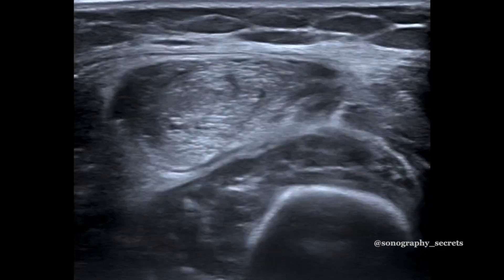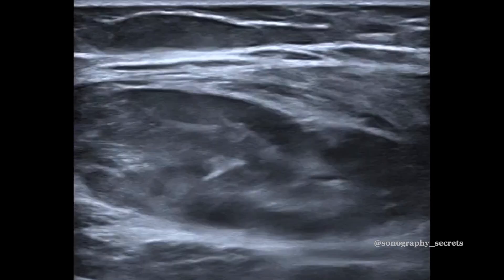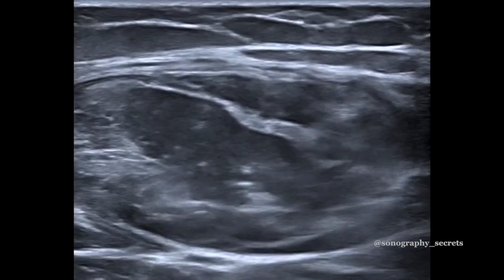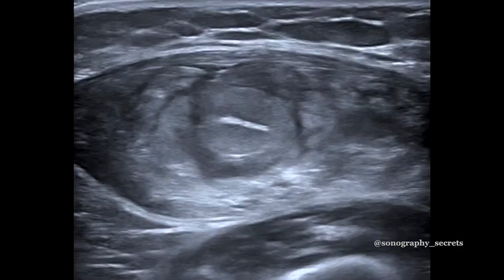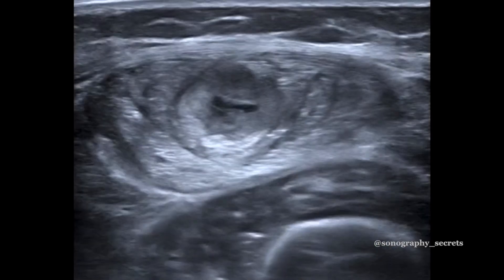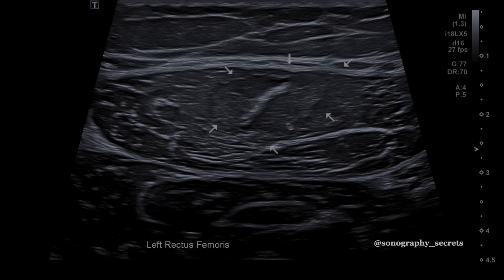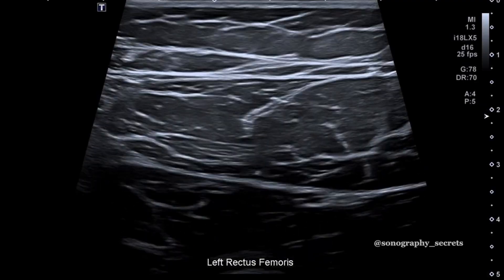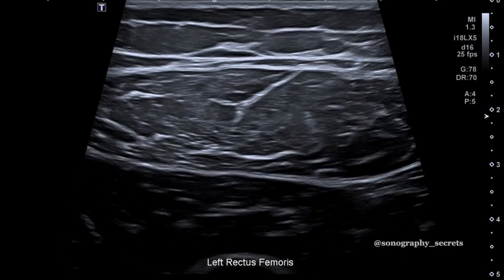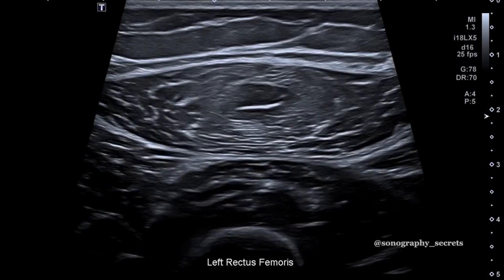This is an intramuscular degloving injury — essentially a dissociation of the indirect and direct component — common in the older teenager especially post kicking, and in spite of the spectacular appearance the prognosis is good and the return to play short. Here is a degloving rectus femoris injury 10 days post injury; we can see evidence of healing and there's also the suggestion of a concurrent MTJ tear of the indirect rectus femoris with an intact central tendon.